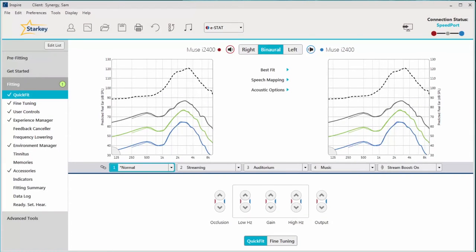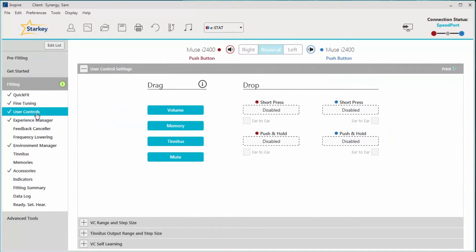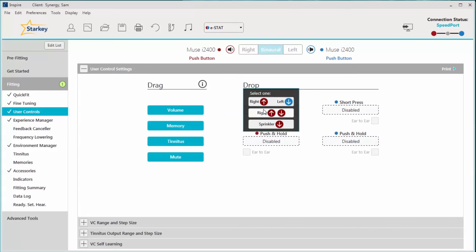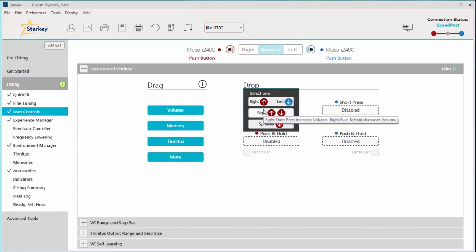While in the Inspire fitting software, simply click on the user controls from the left navigation panel. To activate the volume control for your patient, click on the volume icon and drag it to one of the four highlighted gestures on the right. I'm going to place it here in the short press gesture.